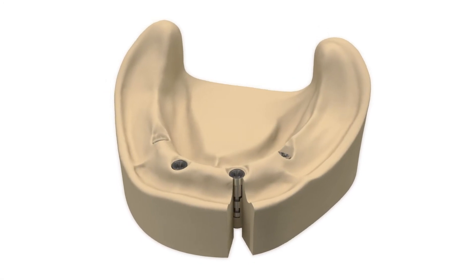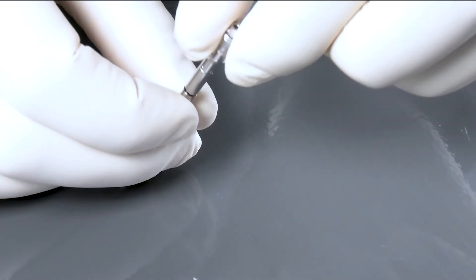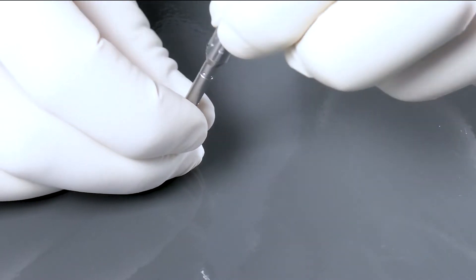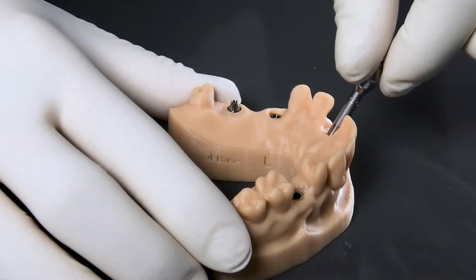The Tealogic TwinFit laboratory implant has been optimized for the digital workflow and can be used for both cast and printed models. With the proven size marking, the laboratory implant can be directly matched to the Tealogic TwinFit implant line S, M, or L.